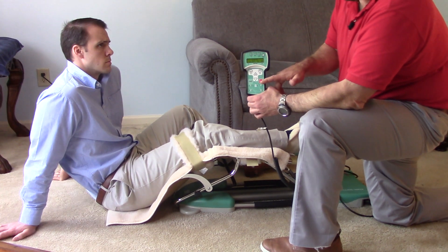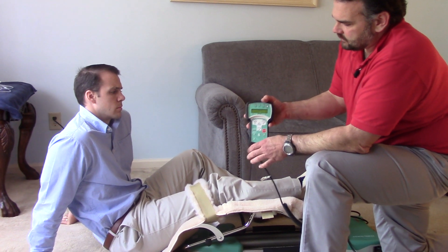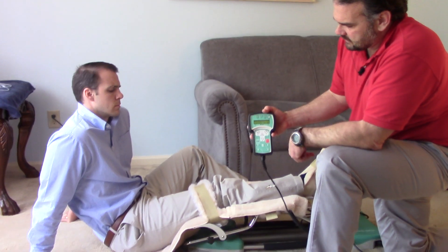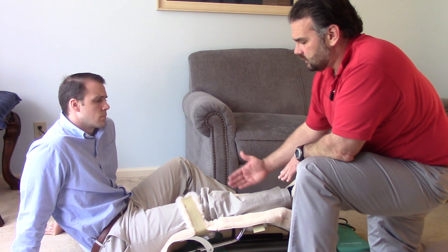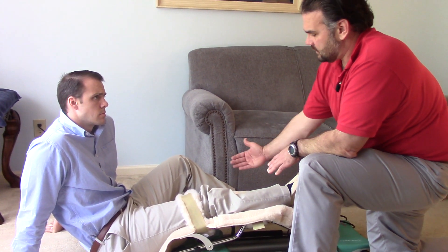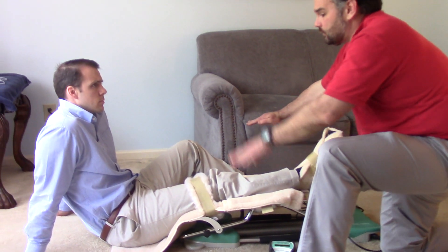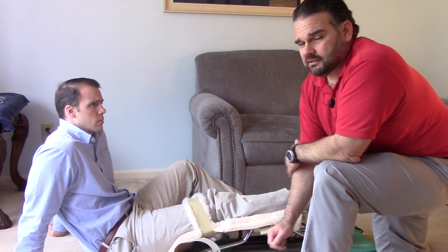It's easier to get in and out of the machine when it's on its lowest point. We're going to stop it when it gets to 10 so that the patient can get out easier. Whatever leg you're having surgery on, it's always easiest to lead with the surgical leg. We have Russ's right leg in here, so you would get into the machine from this side — you don't have to lift the good leg over and then put the bad leg in. Always lead with the surgical leg.